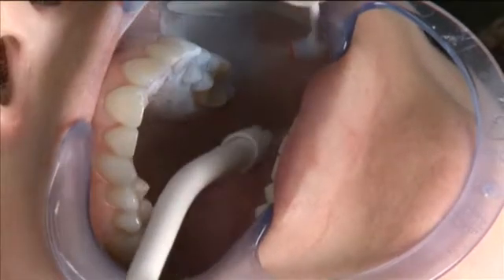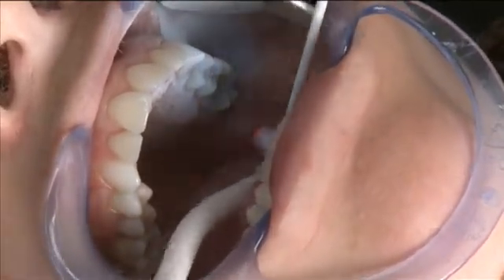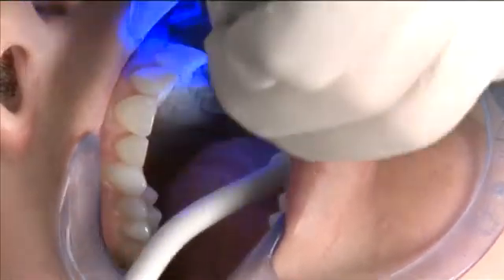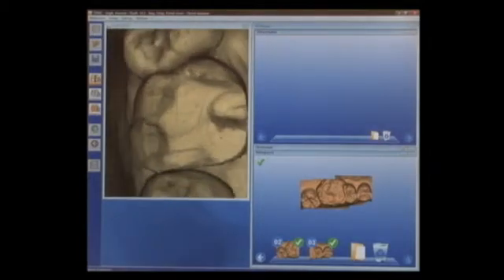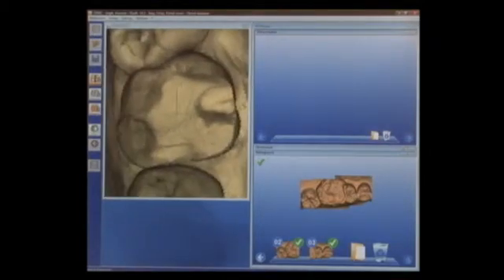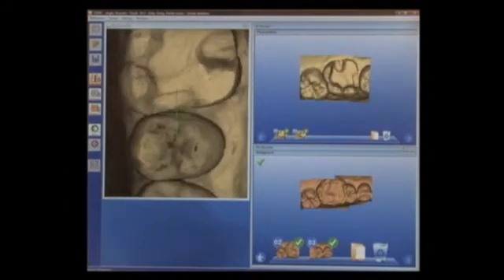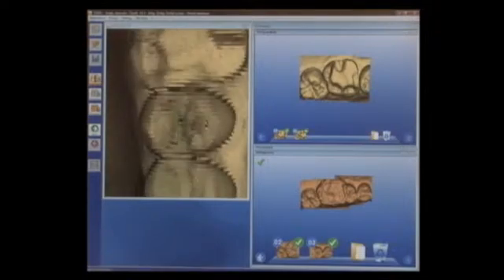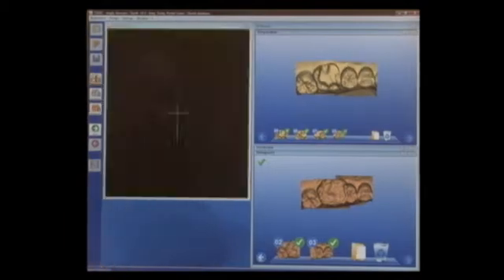I'm going to go directly back into the mouth and spray just a bit more OptiSpray over the prep, and then we'll be ready to capture our images. I'll activate the Blue Cam again, go straight over the preparation itself, center directly over that, then go slightly to the distal, and then move to the mesial in order to capture my preparation images and the adjacent teeth.